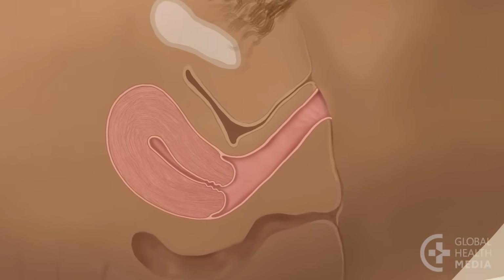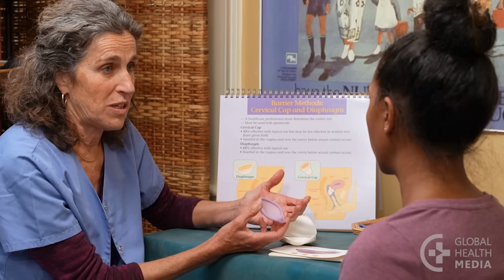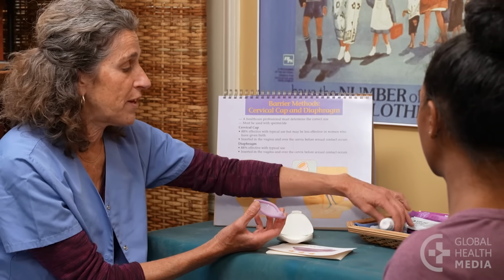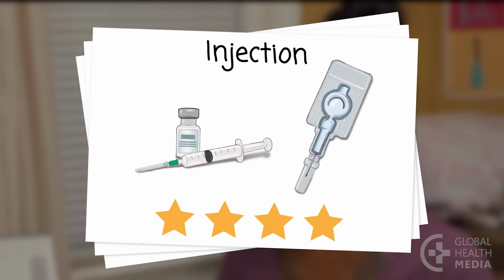The diaphragm works by covering your cervix to keep sperm from getting you pregnant. It's good at preventing pregnancy, but it's not the most reliable method. If it's very important for you to avoid pregnancy, choose a more effective method of contraception, such as the implant, the IUD, or the injection.